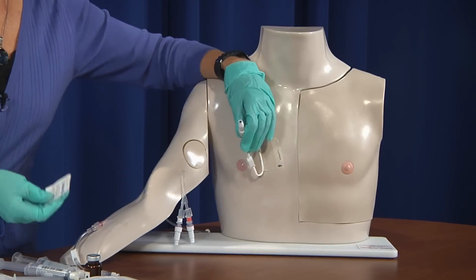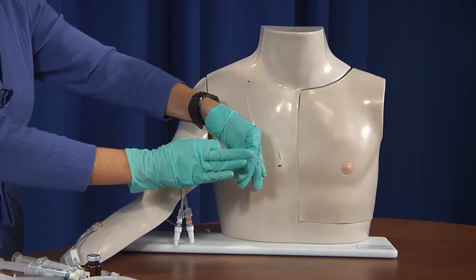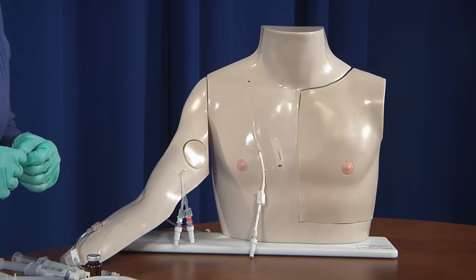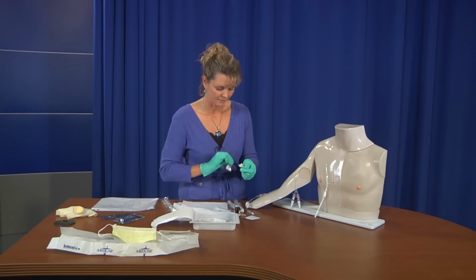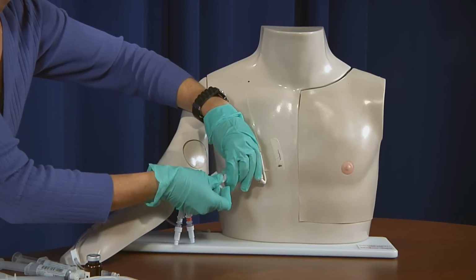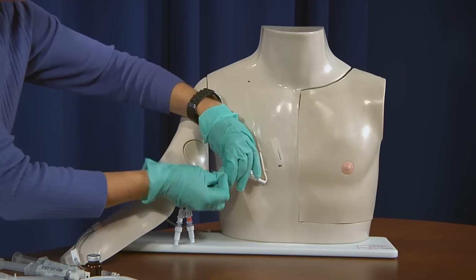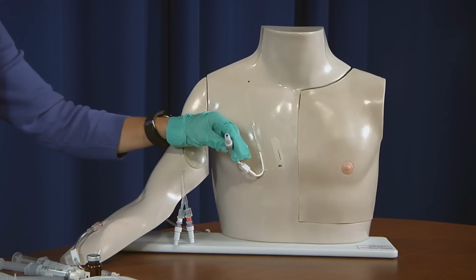So the very first thing you're going to do before you go to any patient and access a line, you're going to pull their policy to see how we're supposed to do this. But just for your benefit of nursing school and having to be checked off on this, we're just going to do it in this way. You're going to take your alcohol, you're going to clean your port. Now, when you do this, you need to tell the instructor you're going to clean it for 10 seconds. You're going to do 10 to 15 with the alcohol. And then you have to let it dry.